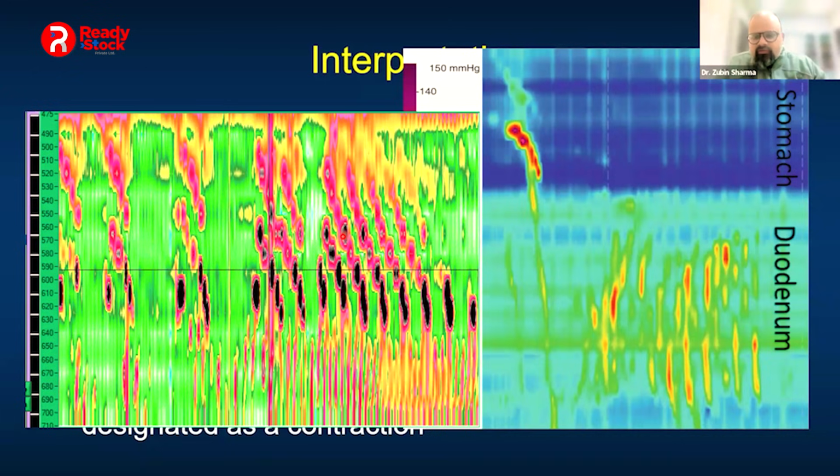This was a case of a functional gastric outlet obstruction. So this is abnormally high antral contraction. So it's not normal. I'm only showing you this because it's seen very beautifully here. So it's hypernormal contractions in this particular study. Usually we don't see that many crowded contractions in the antrum. They are usually 1 or 2 or 3, and then they die down, like the one you can see in this particular book image.